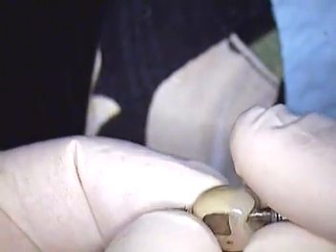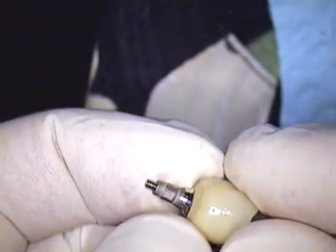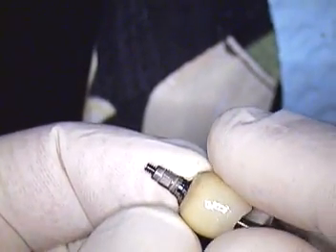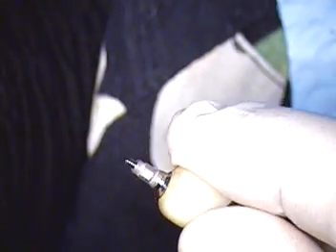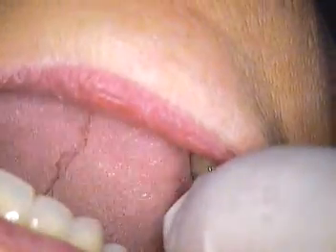Okay, so what I like to do is show you the crown before I put it in. Again, it's got good metal support for the contact zones, because we do not want to in any way cause issues in the interprox over time, because implants do not move. So we warn our patients about chewing on almonds. Make sure the almonds are softened. Make sure you're not chewing ice. Make sure you don't hit anything too hard, because the teeth below it will do all the flexure, but implants don't. So you could chip porcelain, etc.